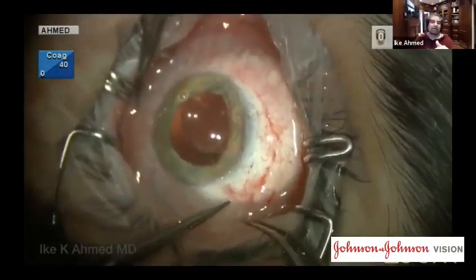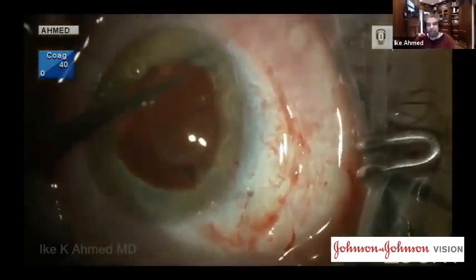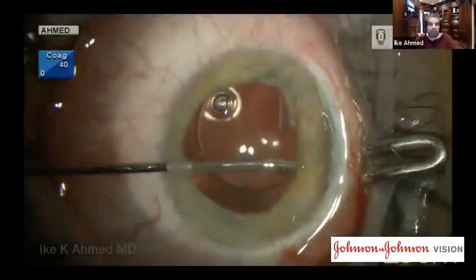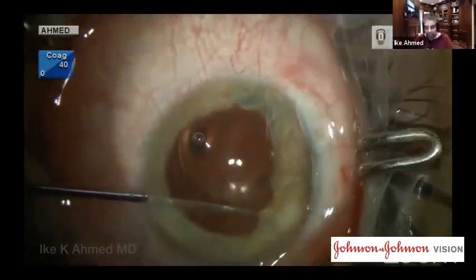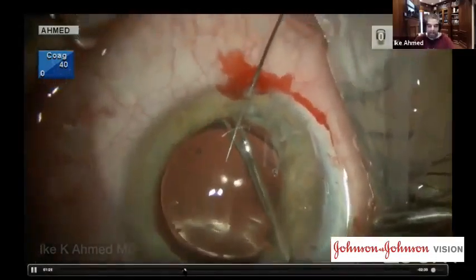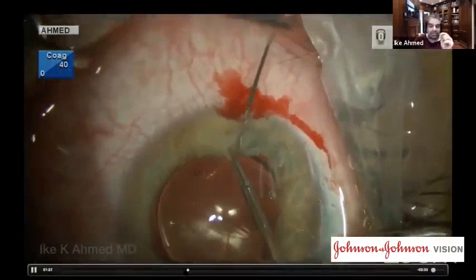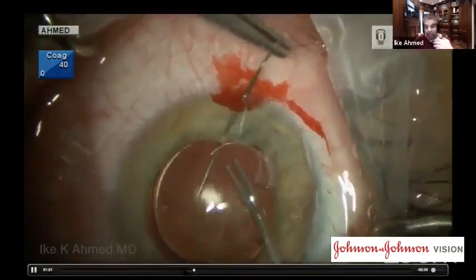The slip knot allows us to titrate the tension, because the concern is that after we do the cerclage, we may loosen the suture or it may break. So in this case, we just did a slip knot. Now here we're going to do the cerclage technique again. I like to start nasally, and this is a CIF4, a curved needle from Ethicon, which is what I use.